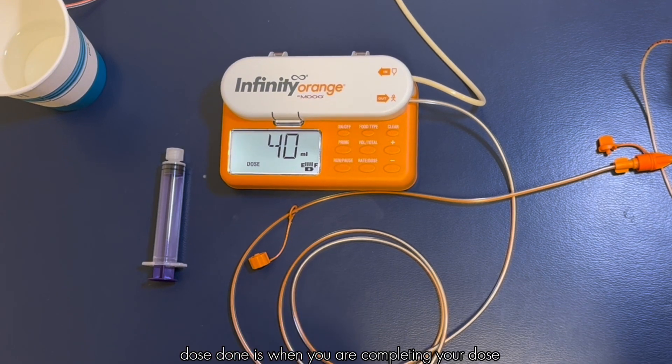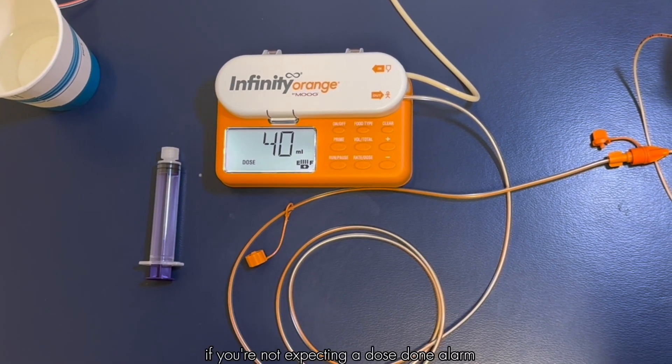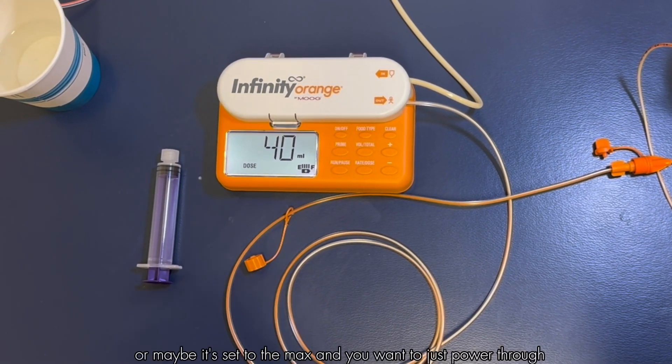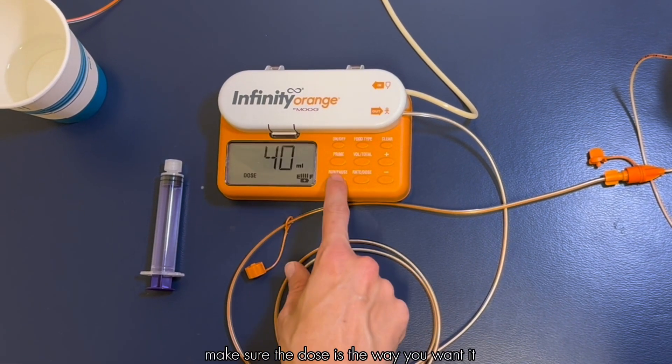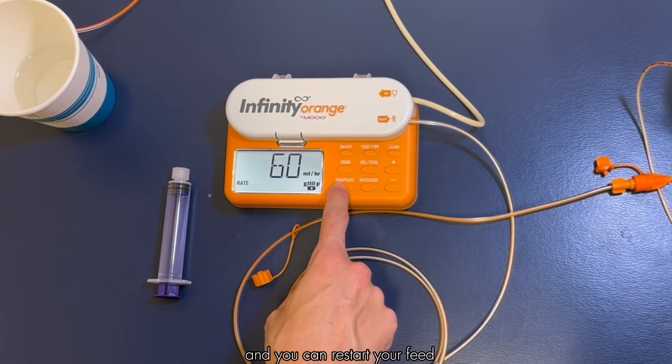Dose done is when you are completing your dose. If you're not expecting a dose done alarm or maybe it's set to the max and you want to just power through, you would just hit run pause, make sure the dose is the way you want it, and you can restart your feed.